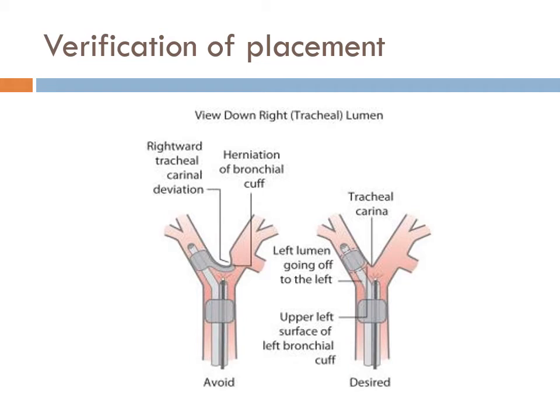You looked, right? So I looked quickly with a Mac blade. I could see a cuff, like a big part of the cuff. And then we got a glide scope so everyone could see, and it was almost completely herniated out of her larynx, despite it being 15. So we actually put the tube in, took the cuff down. We still were ventilating.